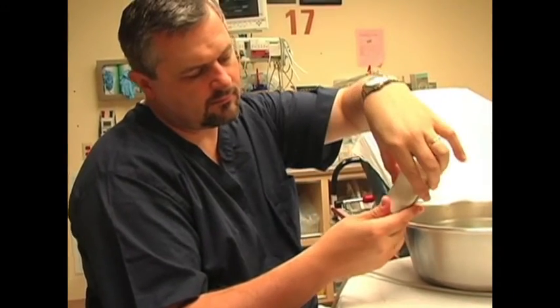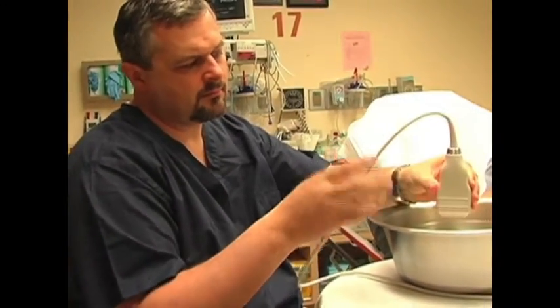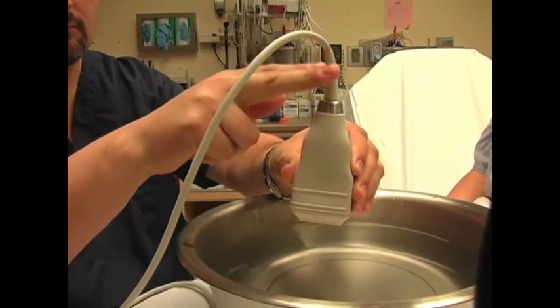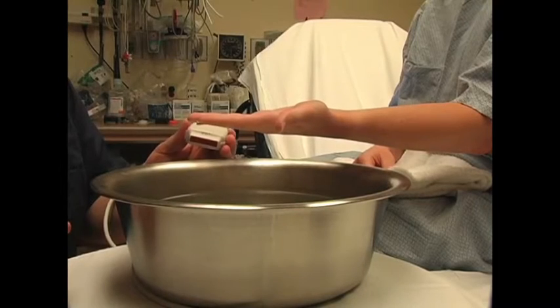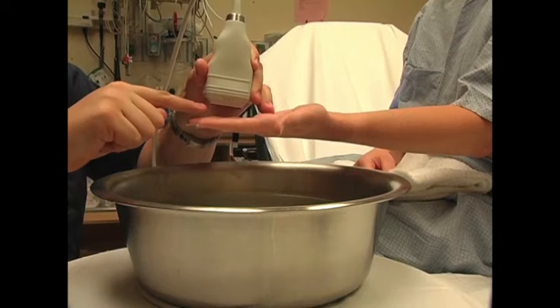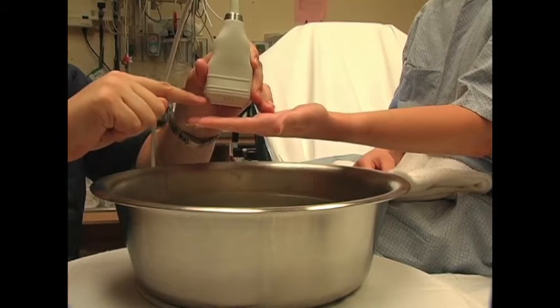The transducer can be submerged in the water bath, but do not get the junction of the cord and the transducer wet, as this area is not watertight. The key principle is to keep the ultrasound transducer about one to two centimeters from the finger, as is illustrated here.